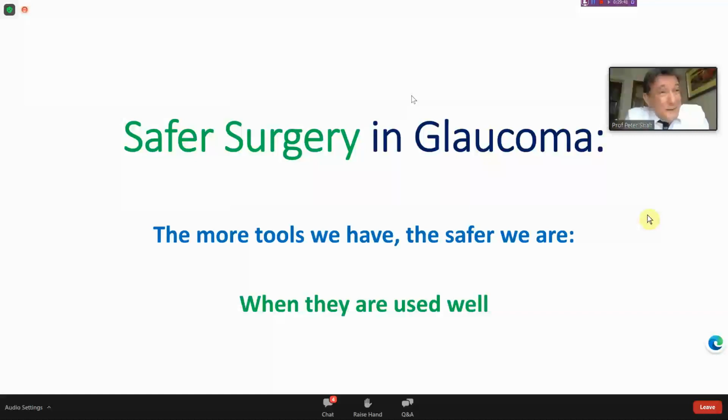Imran, that's great. I mean, you know me, I have a few of my kind of Shah's rules and Shah's equations, and viscoelastic plus blood equals pressure of 50. And so I think that's a really, I love these kinds of elite surgical anecdotes because they actually guide us. You never get this out of a paper. This is the real world, what we have to do every day.